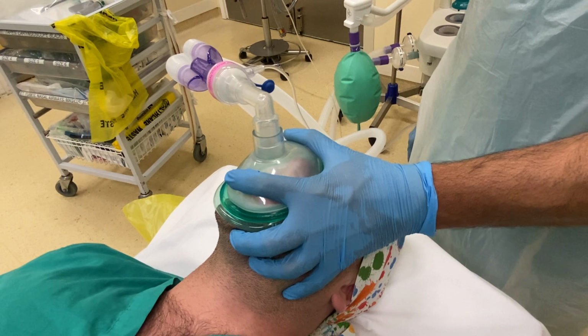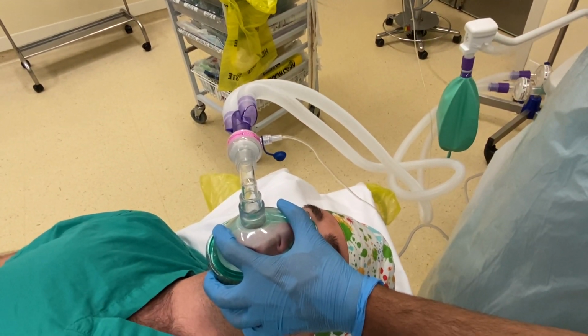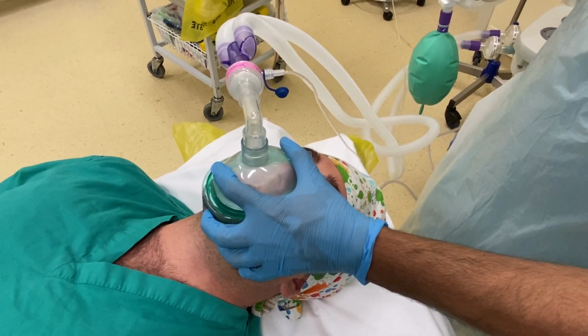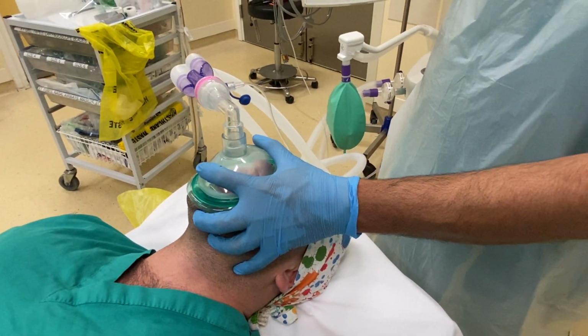If you're holding a mask like this, keep your hand away from the patient's eyes. This can be really claustrophobic and unpleasant for some patients. So you don't want to be covering their eyes. They're already scared when they're having an anaesthetic and surgery. So that's two ways to hold a mask when a patient is awake.